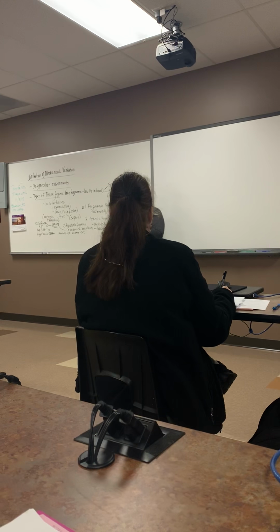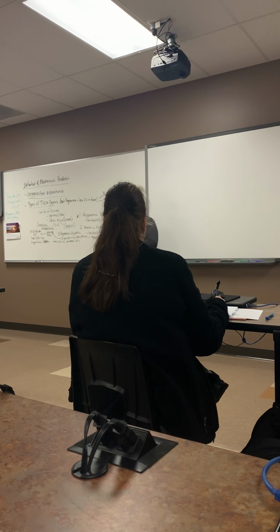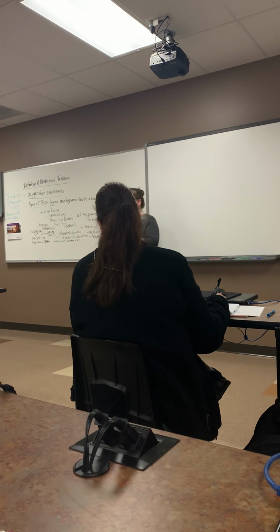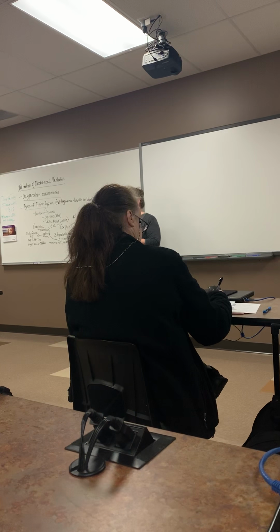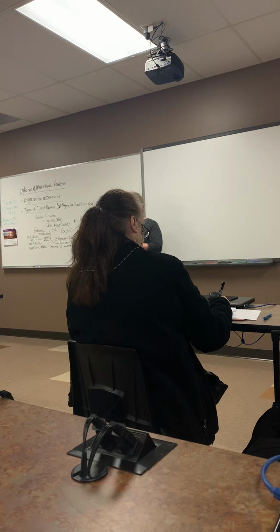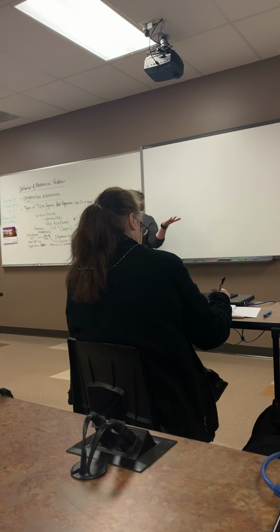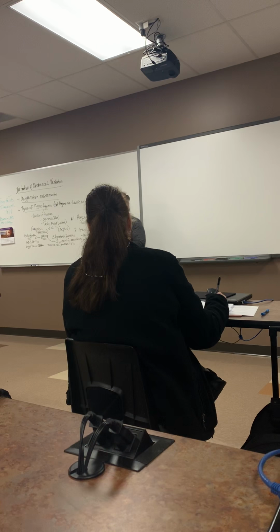So the test is called a co-oximetry, as you know. What's the other name for it? Does anybody know? Hemoximetry. So when you're going to test for carbon monoxide, you need to do a co-ox or a hemoximetry, or a carboxyhemoglobin level, whatever the word is. You'll see various things.